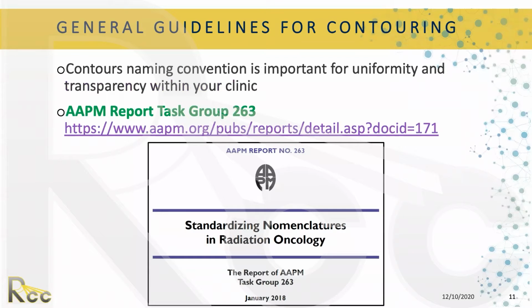Another point I want to go through quickly, and this is important in our institution, is that we discovered it's important to standardize the names of the contours, the nomenclature, how we call things. That makes the clinic more uniform and transparent. If you need to share information between your colleagues, you're going to be talking about the same things instead of ambiguity. So in 2018, the AAPM released this report, Task Group 263.